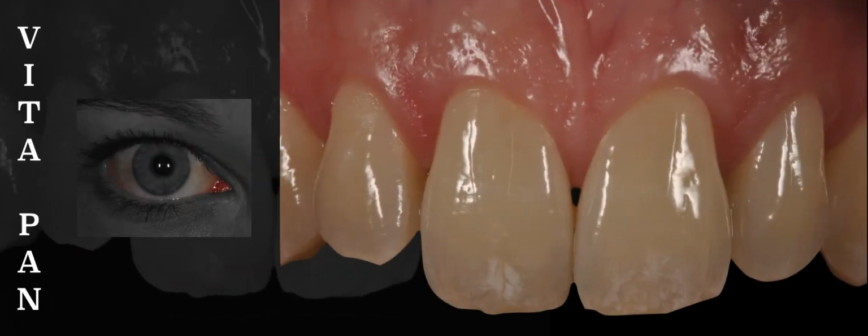Once we understand the shade tab, let me explain the way I use the tab clinically and give you the reason why. We are going to divide this by steps. So step 1, look at the teeth or tooth you need to match. This should take no more than 5 to 10 seconds. The longer the time, the more chances for error. This has to do with the physiology of the eye and the way that cones work as photoreceptors.